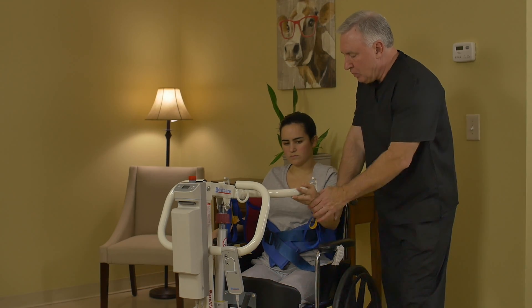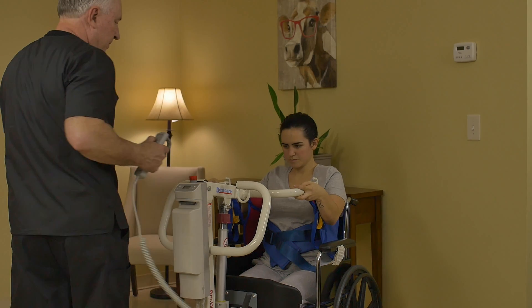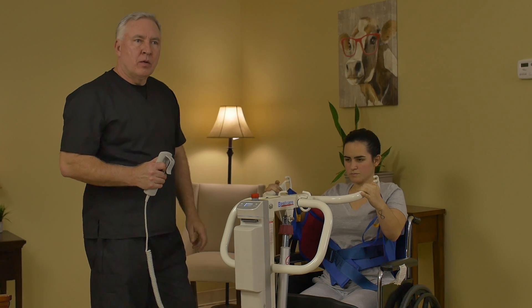The patient's arms go around and hold on in this area. As the bar starts to raise, the patient will have a more natural way to grip the bar.